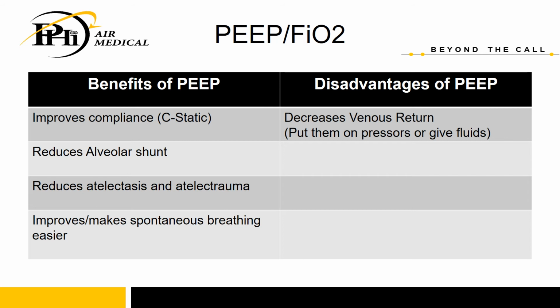But if we give just a little bit of volume, so we turn that small balloon into maybe the size of a softball, and then we pinch it off and hand it to somebody else, it's going to take them much less force in order to blow their full breath into that balloon. And that is really what PEEP does in essence.